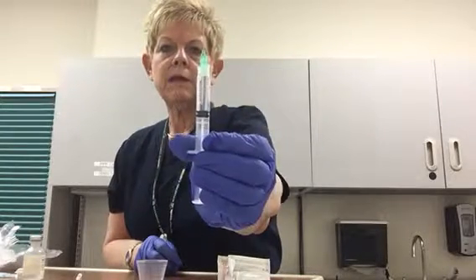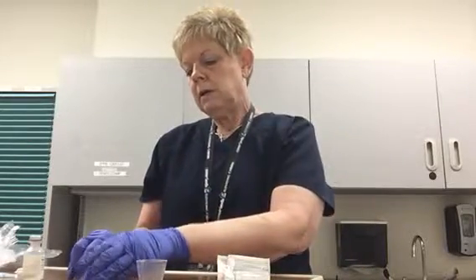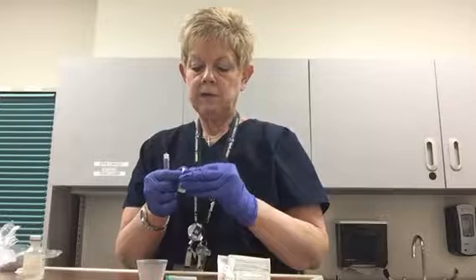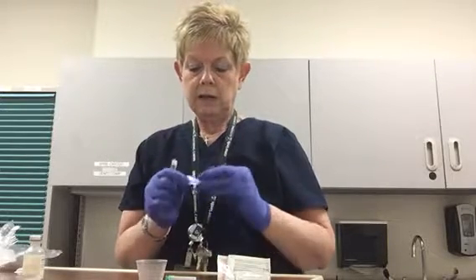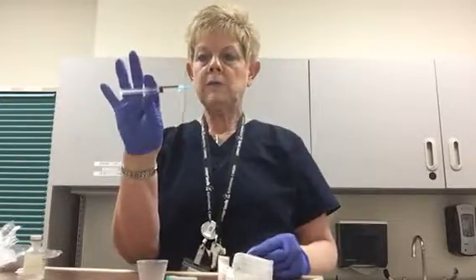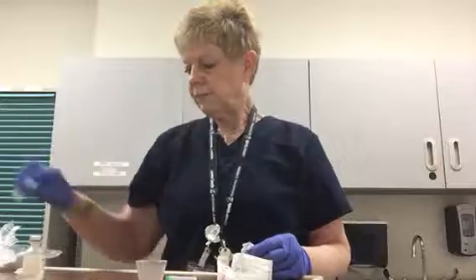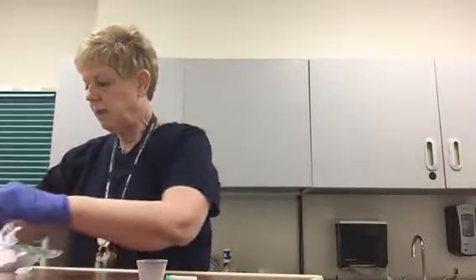I've got two milliliters of medication drawn up. Now I need to recap my needle — remember, this is not a two-handed process; this is a one-handed scoop. You come down here and scoop the cap onto the tip of the needle. We are going to remove this needle because you would not want to use it again. It's just easier to put a cap on the syringe here. At this point, I would label my syringe with the content of the medication, my name, the date, and the time I drew it up, so I know precisely who it's for and what's in it.